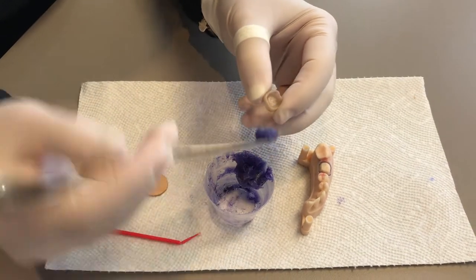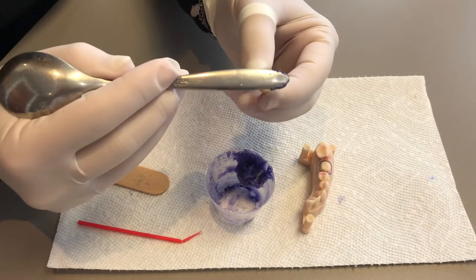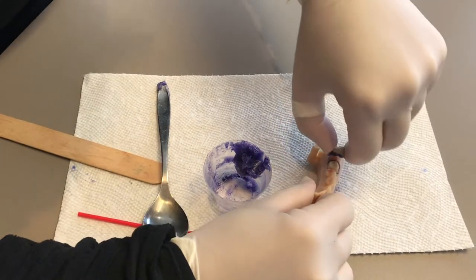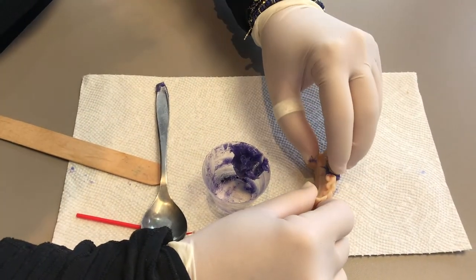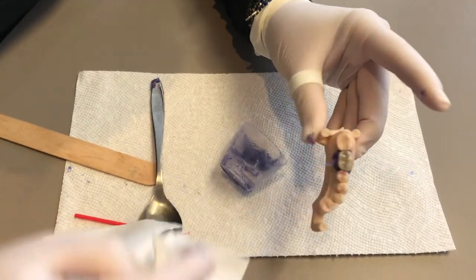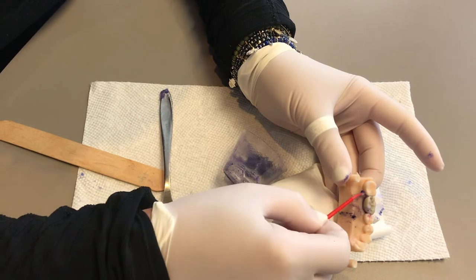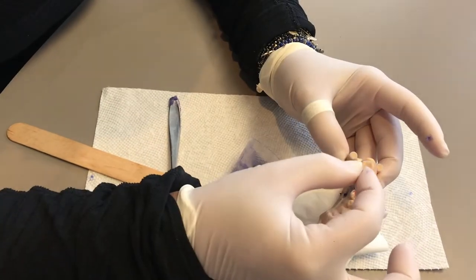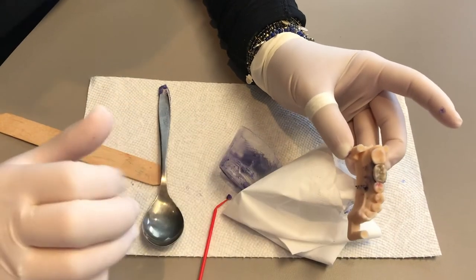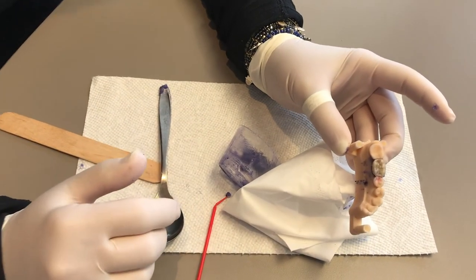Take a little bit with like the end of a spoon or a small little applicator. Squeeze some in here into your crown, put the crown back into your mouth on your tooth, squeeze it right down, clean off the excess. You can take a toothbrush and just brush some of it off, and then floss down, pull through, don't flick back out — and your crown is back on for a while until you can get in to see your dentist.